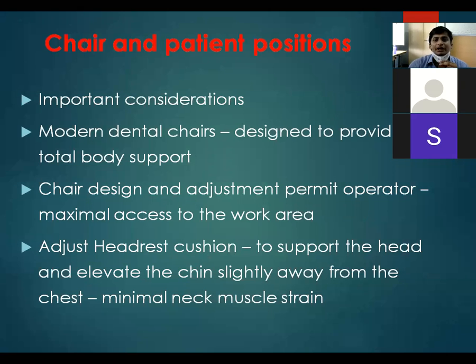Coming on to the chair and patient's position. Again, this is a very important consideration for both patient and operator. Modern dental chairs are designed to provide total body support. Compared to the old chair, you can see many advanced chairs coming up, and they are giving proper body support to the patient. Chair design and adjustment permit operators maximum access to the working area.